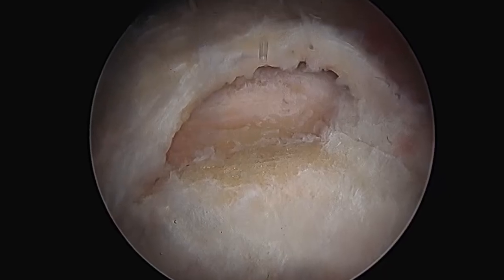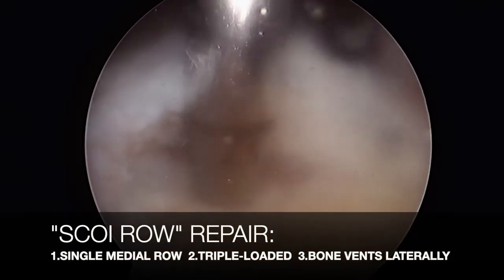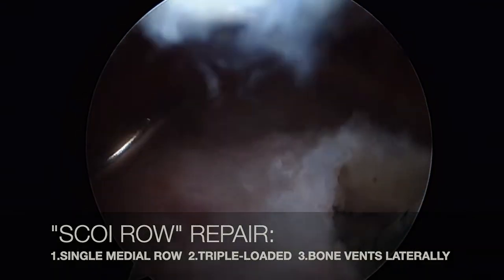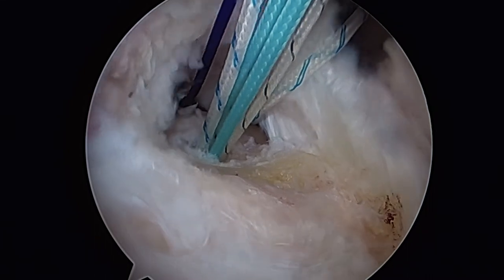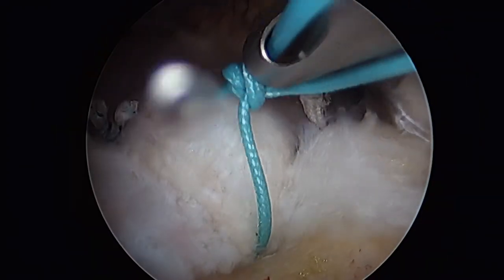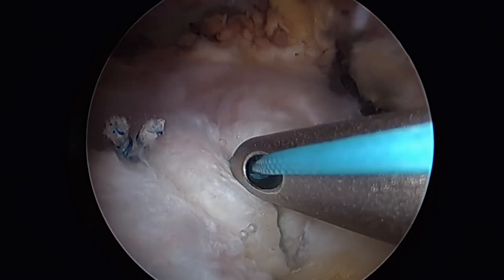Single row repair technique. For this case we've selected a single row, SCOI row type repair. We'll place a triple-loaded suture anchor approximately three to four millimeters lateral to the articular surface. Then we'll use standard antegrade suturing technique with suture hooks and shuttles to pass each of the three medial-sided suture limbs across the rotator cuff one at a time. You can also use any number of retrograde suture passes as well. We'll then tie down all three sutures, and this will complete the repair.